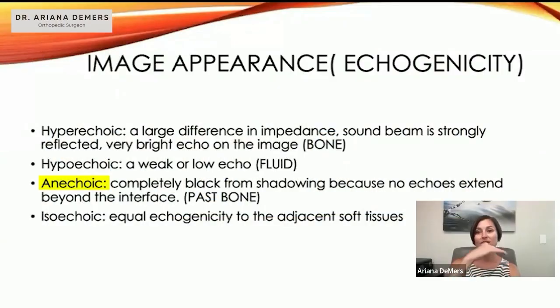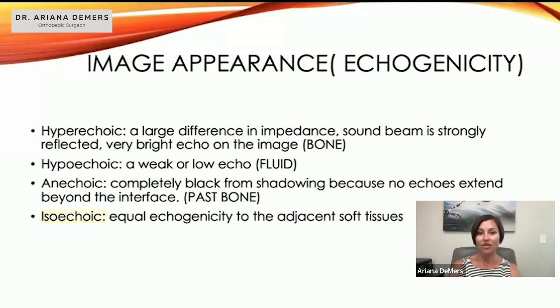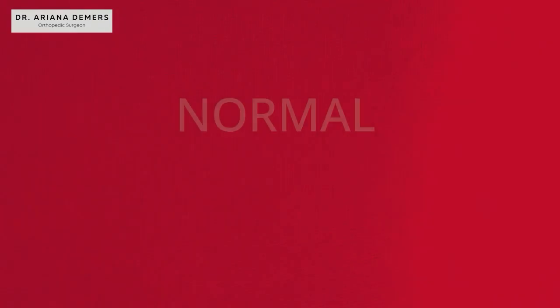When you see bright white, that's bone, and the black shadow behind it is anechoic. Isoechoic means equal echogenicity to adjacent soft tissues, just as in the other picture.